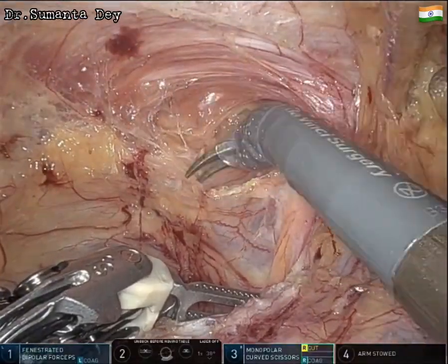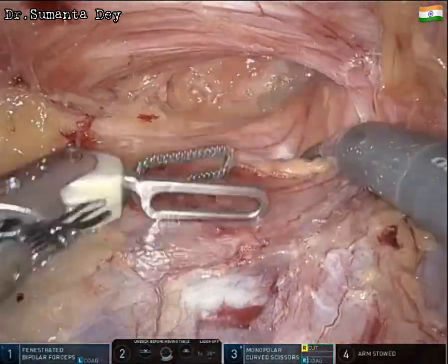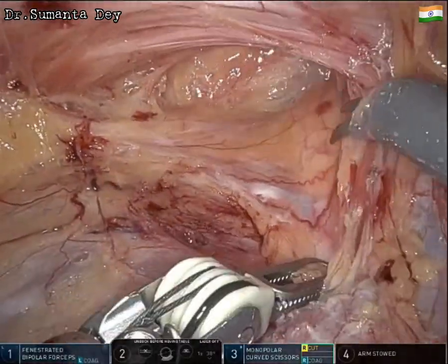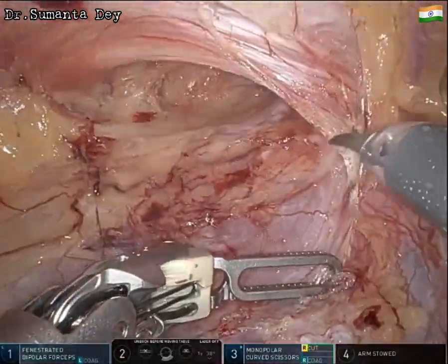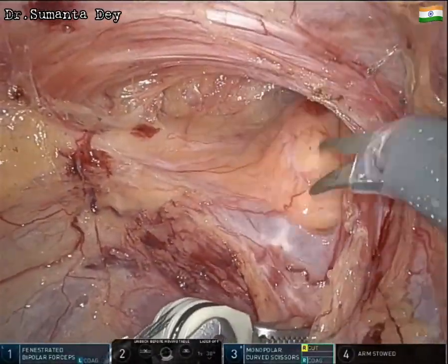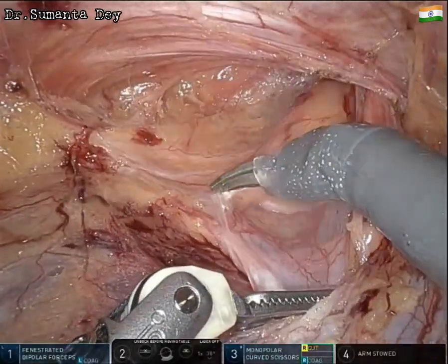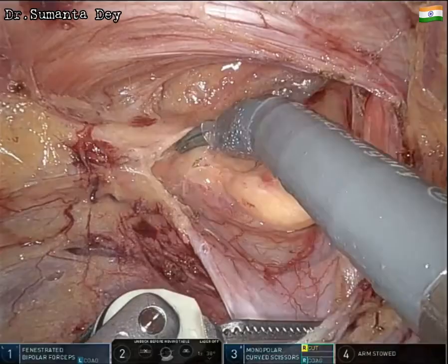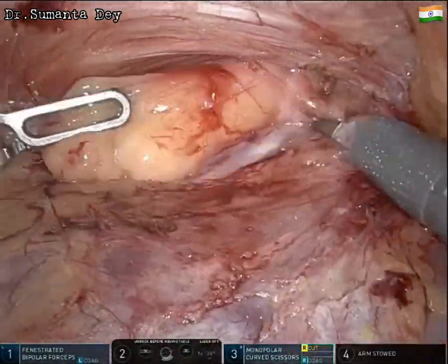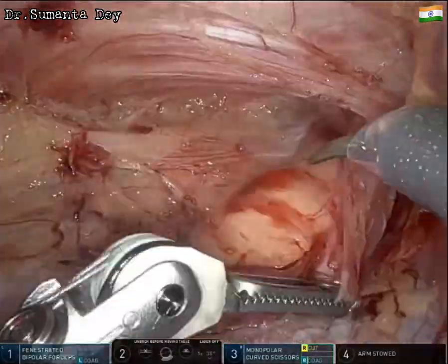This patient had a complete sac — the hernial sac was containing the testis as well. In a complete sac, dissection becomes difficult because the sac cannot be completely reduced; at a certain point the sac must be divided and then repaired. As the sac is pulled, a large cord lipoma is found and is separated from the lateral aspect of the sac.